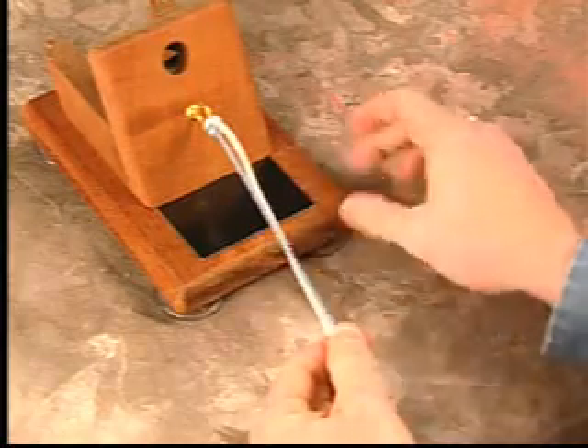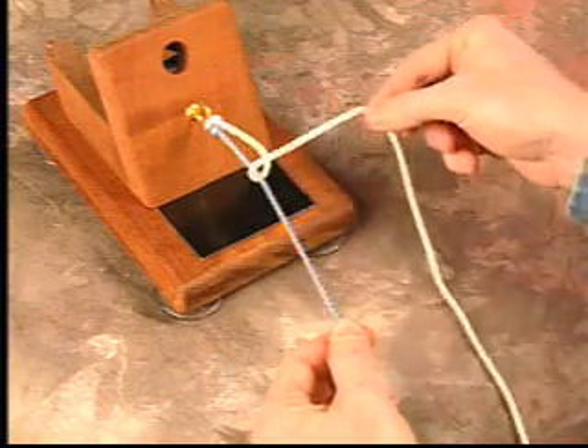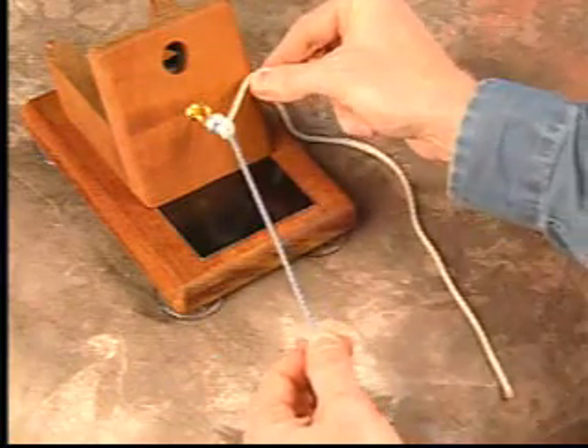This is followed by an overhand half hitch throw while maintaining tension on your post limb so that the knot will not back off.